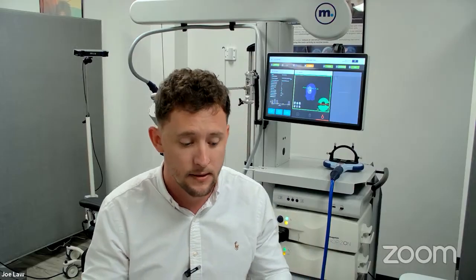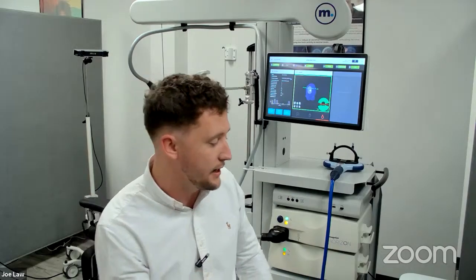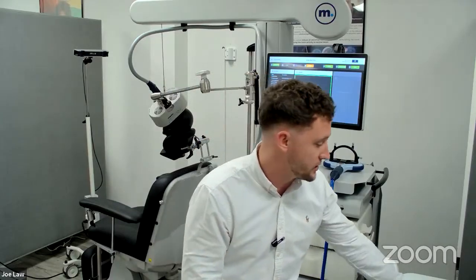very nice because, say, for example, you had a small portion of patients that weren't responding well to treatment. The software will show you if there's any correlation with maybe one treater or technician that isn't performing as well as the others. So the analytics are really nice. It's kind of limitless, but that gives you an idea of how it works.